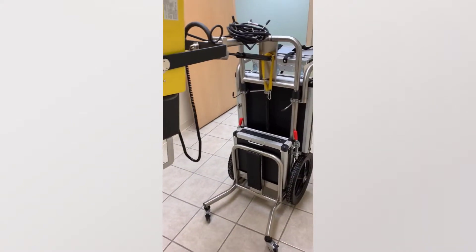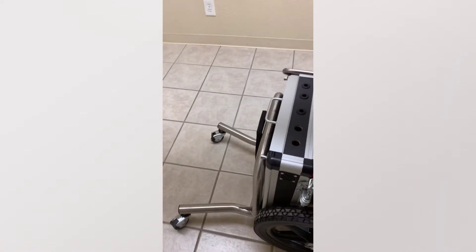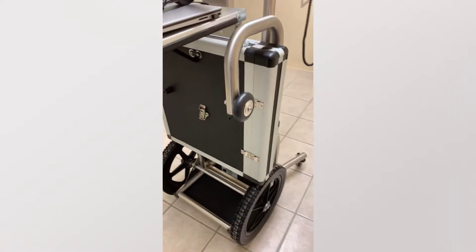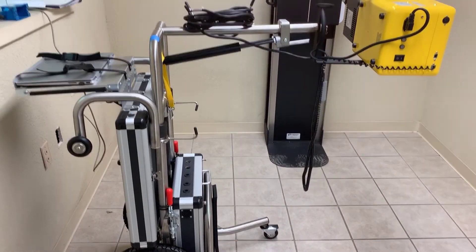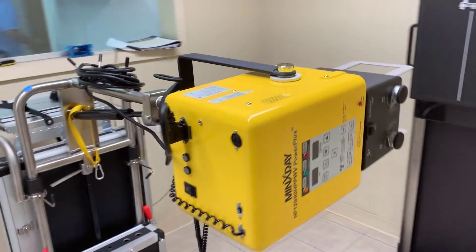Once again, easy to use. Easy to rotate when the wheels are not locked. Well designed. In the case of a small room, you can turn this at any angle you want to be able to get the positioning.